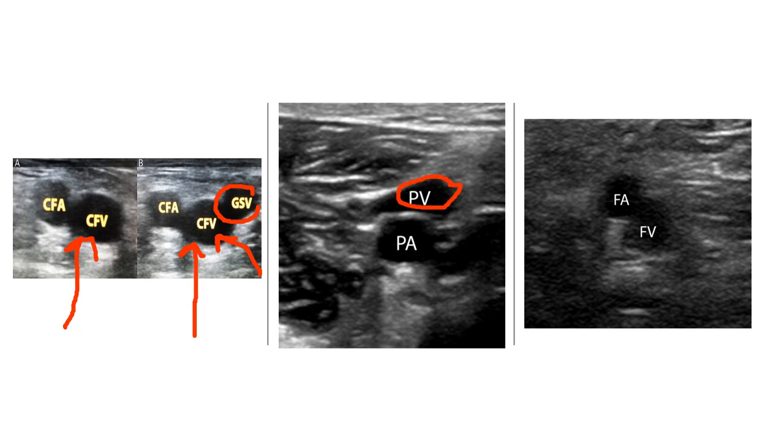And when we come down further from that, we're now going to be in our femoral vein and our femoral artery, which we're going to follow. It's going to look just like this picture all the way down from our upper thigh down to our popliteal vein. The difference with the popliteal vein is that once it goes behind the knee, it flips, and you'll hear the term pop on top. So that means that typically the femoral vein is usually below the femoral artery, just like in this picture. But when we're now behind the knee looking at the popliteal, our popliteal vein is going to be on top and our popliteal artery will be on the bottom in most patients.